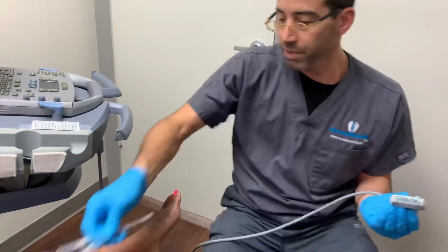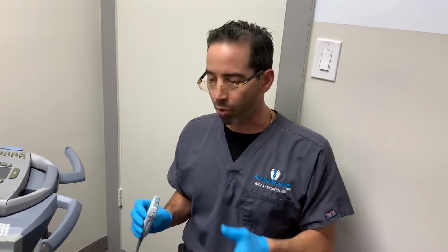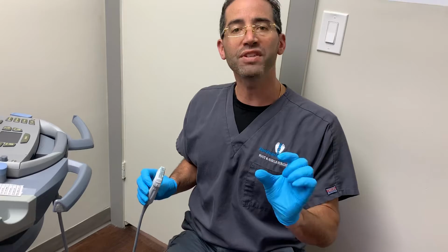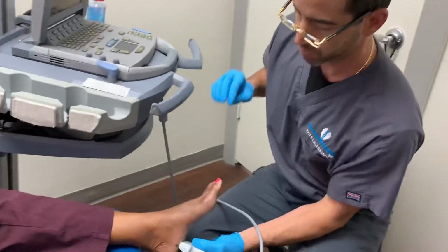And by the way, in my experience, in chronic stages, a lot of people may say, well, more volume is better. Let's inject 3 cc's or 4 cc's, right? It doesn't really work like that. What we're essentially doing is we're just injecting just enough to find out if we can alleviate some of that discomfort. Okay? So without further ado, right?